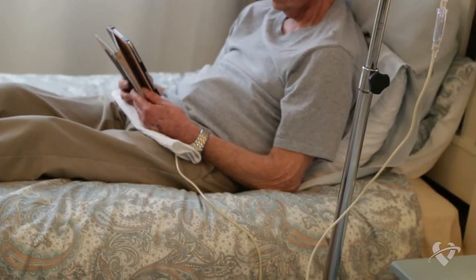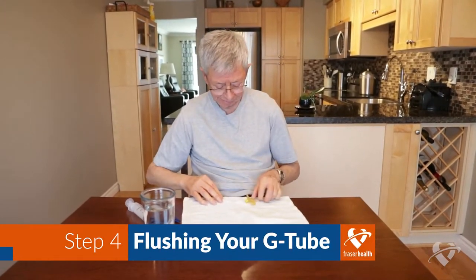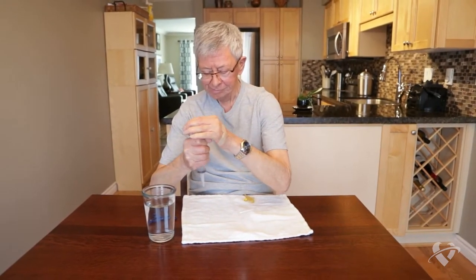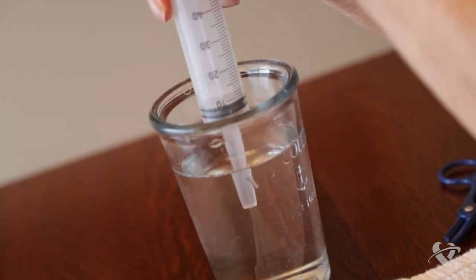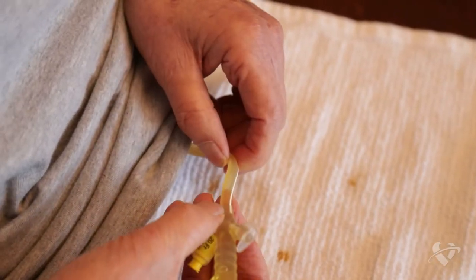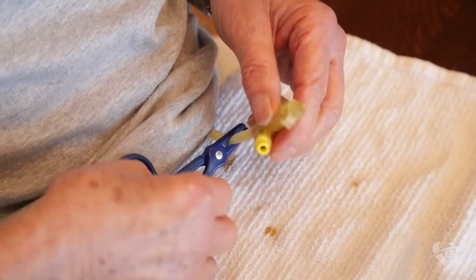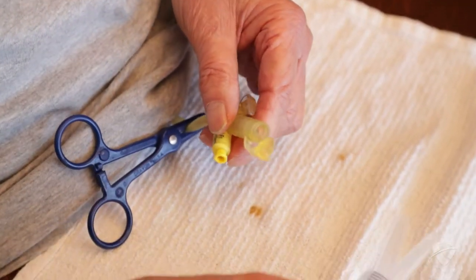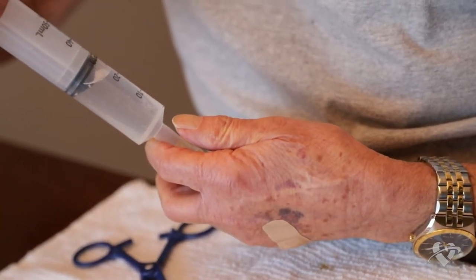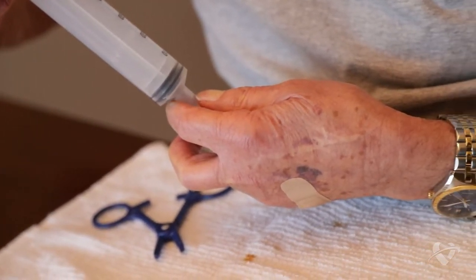Place the towel on your lap. Flushing your g-tube before feeding yourself helps to clear anything that might be blocking it. Using your syringe, draw up the recommended amount of water or at least 30 milliliters from the container. Clamp or pinch the g-tube with your fingers to prevent stomach content from leaking out. Uncap the feeding port and insert the tip of the syringe.